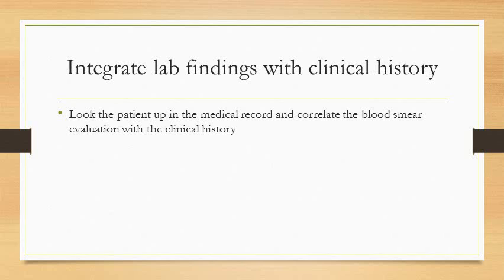And then last, integrate the lab findings with the clinical history. So at this point, you have your differential based on your review of the blood smear, and look the patient up in the electronic medical record and see how it correlates with the clinical history.